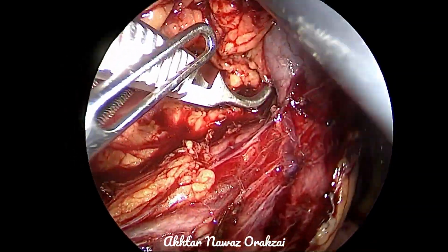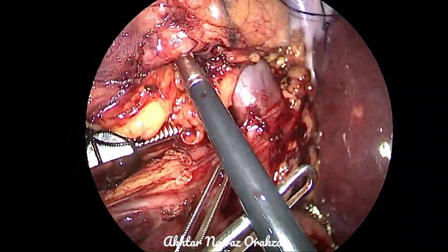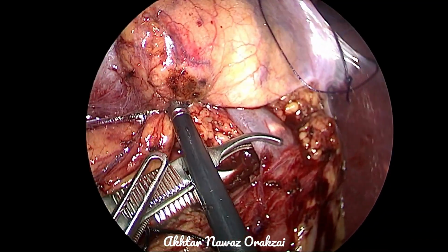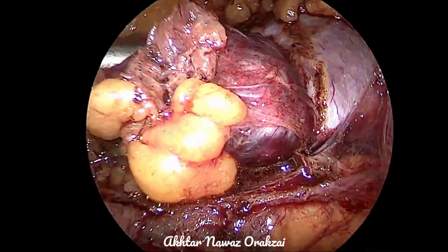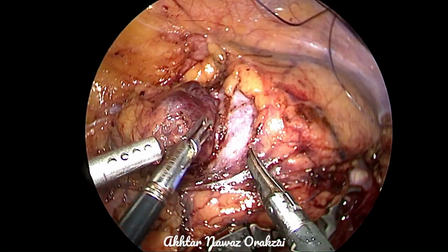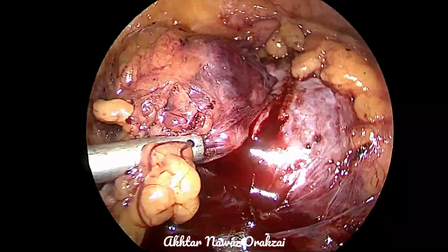Yes. So this is now complete, and we are going to apply the bulldog clamp, which you can see applied very well, and we see that there is no patency, the vein is not distending. The problem that occurred here is that I could not apply the bulldog on the vein completely because of risk of piercing the vein with the tip of the bulldog. So, as the color of the kidney has already changed, we decided just to apply the venous clamp for as much as we could.